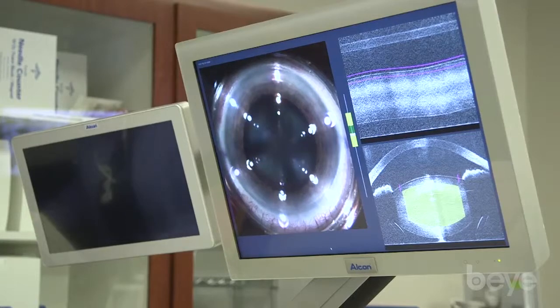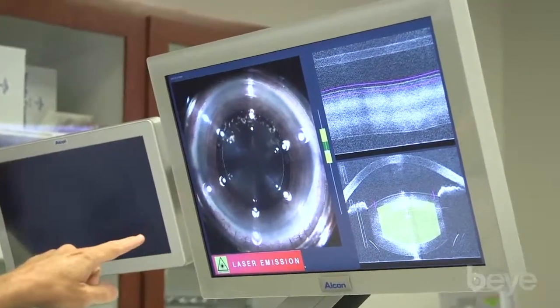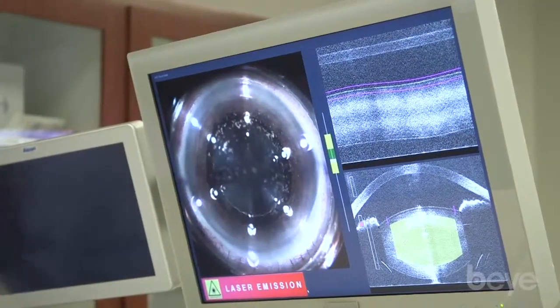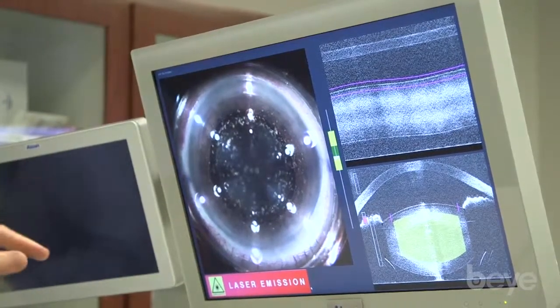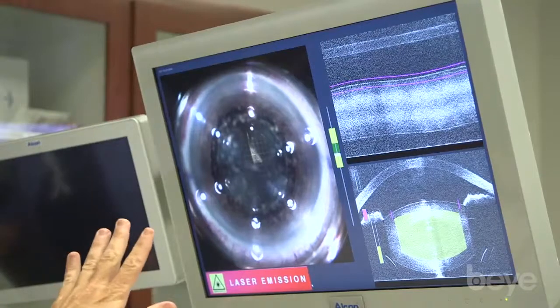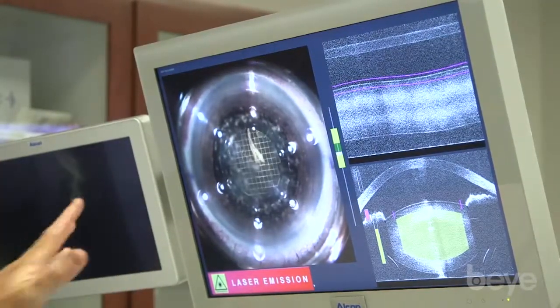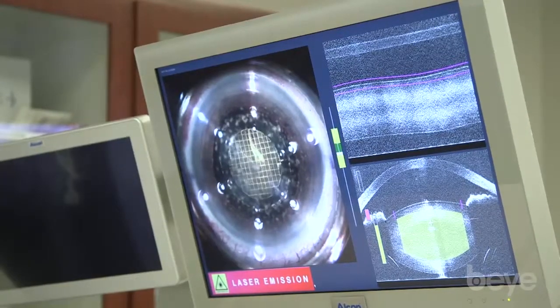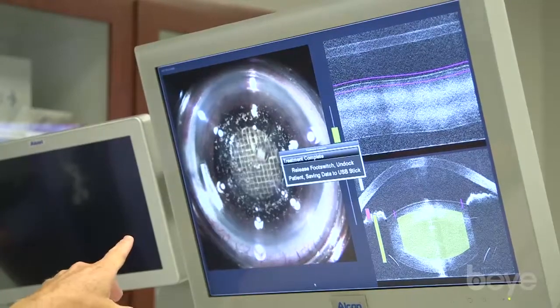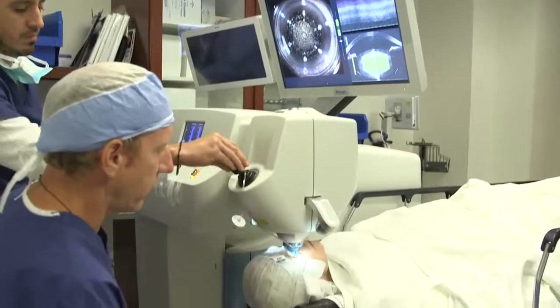The patient holds still as the laser works. By stepping on the pedal, we can watch the screen and watch the laser working. You can see it first cuts the capsulorrhexis — little bubbles form in the anterior chamber, which is how we know we're getting a complete cut; that's gas release. Then it drops down into the bottom part of the nucleus and treats from bottom up, performing a matrix fragmentation pattern — some people call it a waffle or cube pattern. Then there's the arcuate incision. That's a very basic, simple LensX operation.